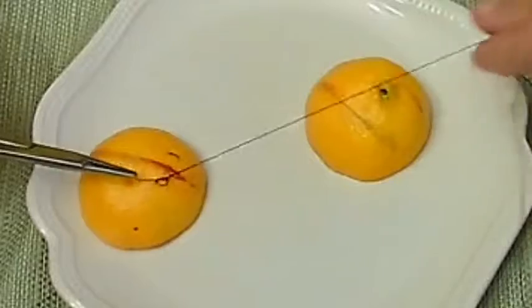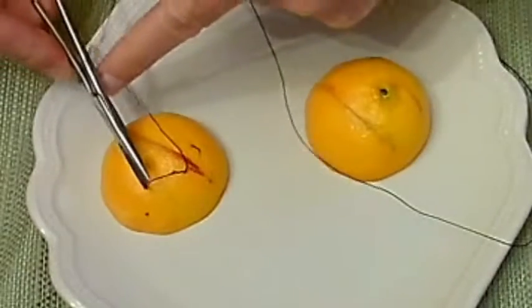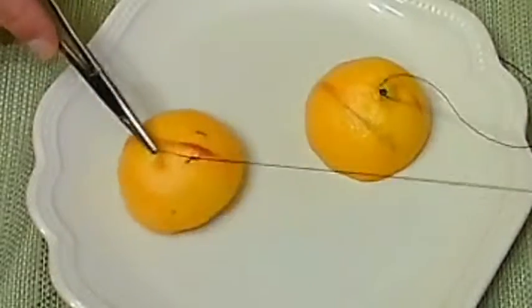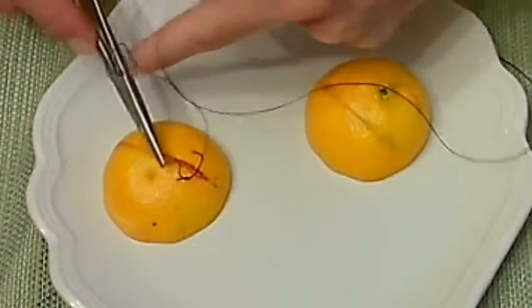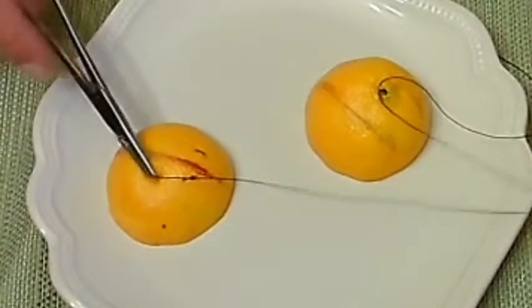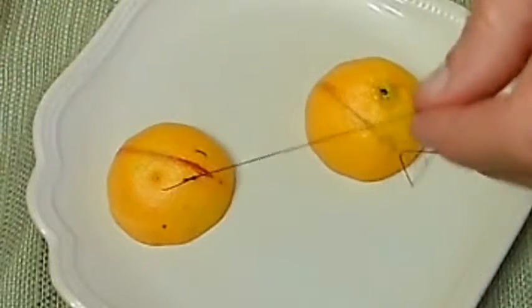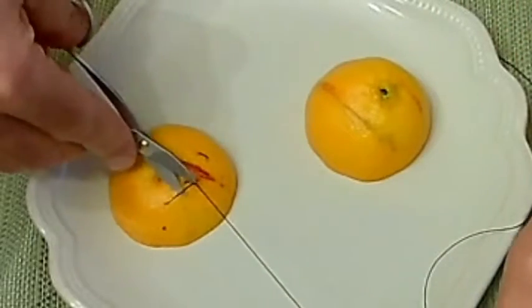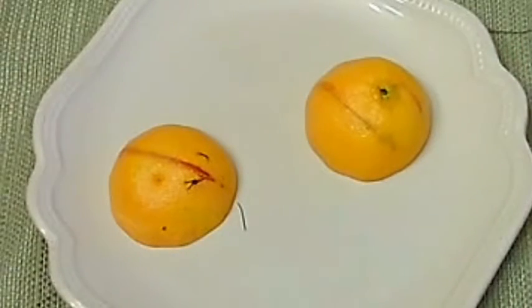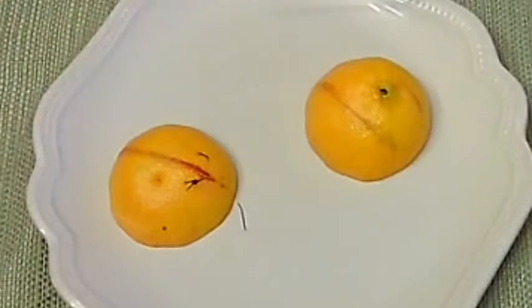Sometimes the suture gets a little stuck on the end of the needle driver and you have to pull it off with your fingers. Double throw on the first one, then single throws on the ones after that. Try to lay them down in the direction of the knot. Usually do a double throw and three or four single throws, sometimes five. And that's a horizontal mattress stitch.